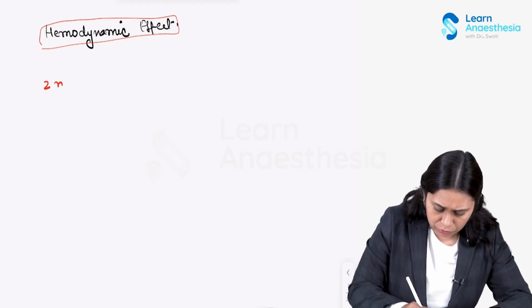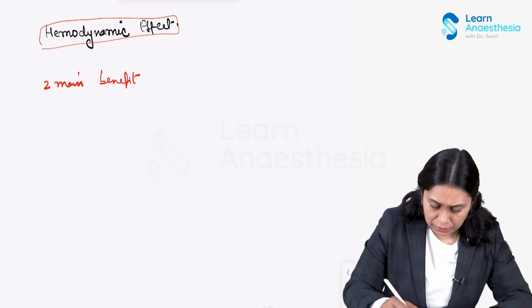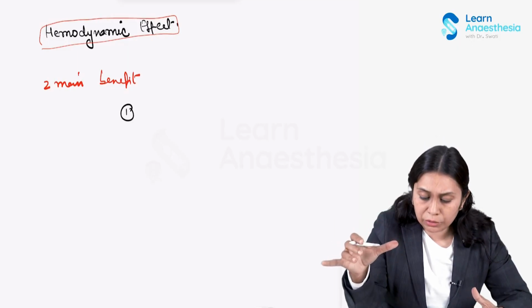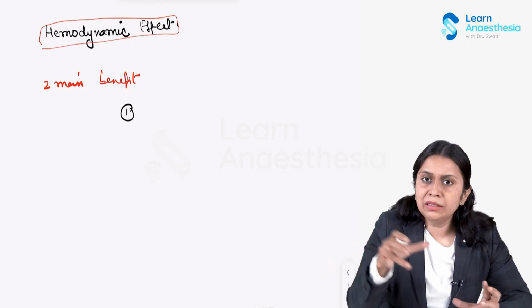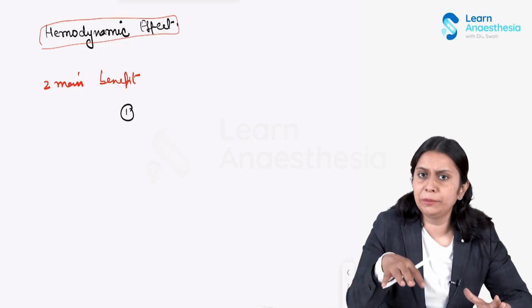The first benefit is that blood is displaced in the proximal aorta by inflation during diastole, and this displacement of blood would improve the coronary perfusion.